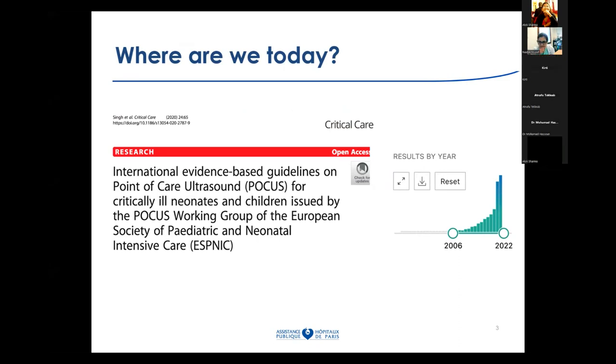So where are we today? Well, we've come a little step further. When it comes to neonatology, we have the European point of care POCUS guidelines with cardiac POCUS, lung POCUS, and then abdomen and brain. In addition, we have different guidelines when it comes to TNE, NPE, whatever we call echo performed by the neonatologist. But I'm sticking to POCUS.